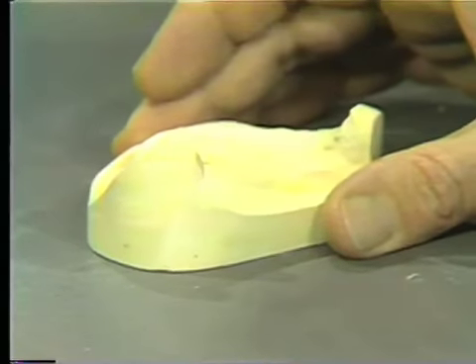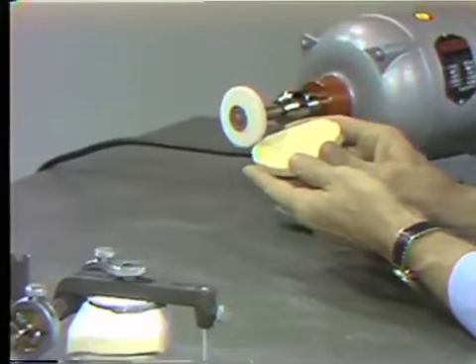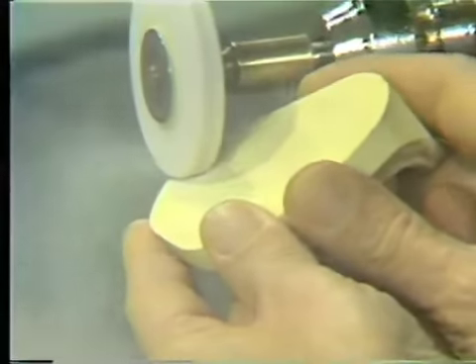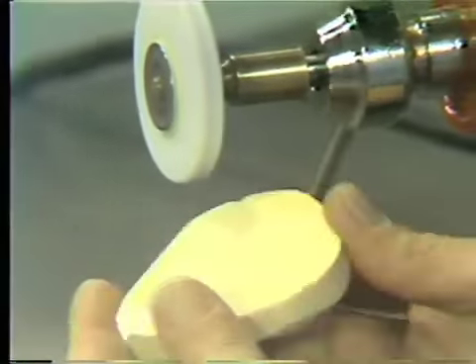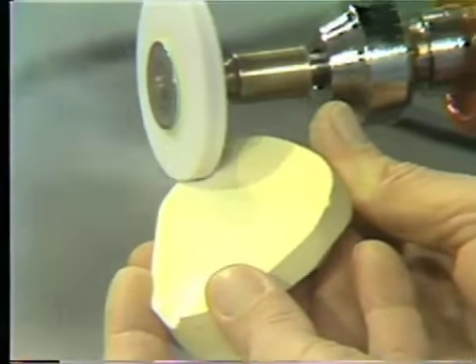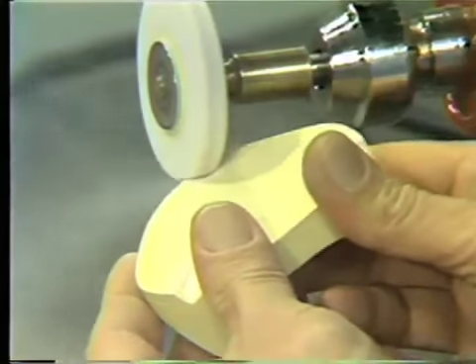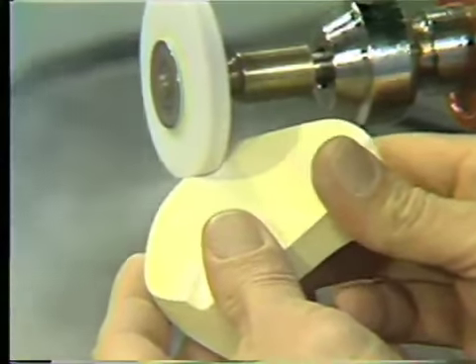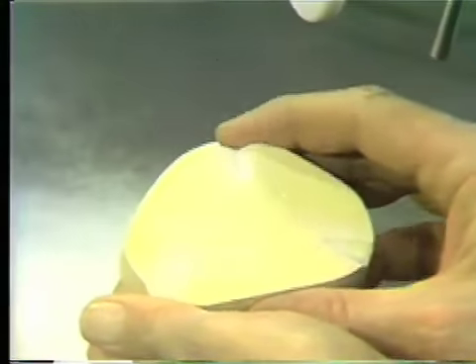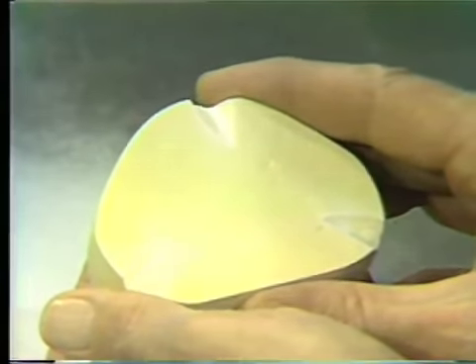We now will groove the base of the cast so to give us some definite mounting indexes. We'll prepare one on either of the 3 corners. We now have 3 indices, which will lute our cast to the mounting of the articulator with accurate relationship.